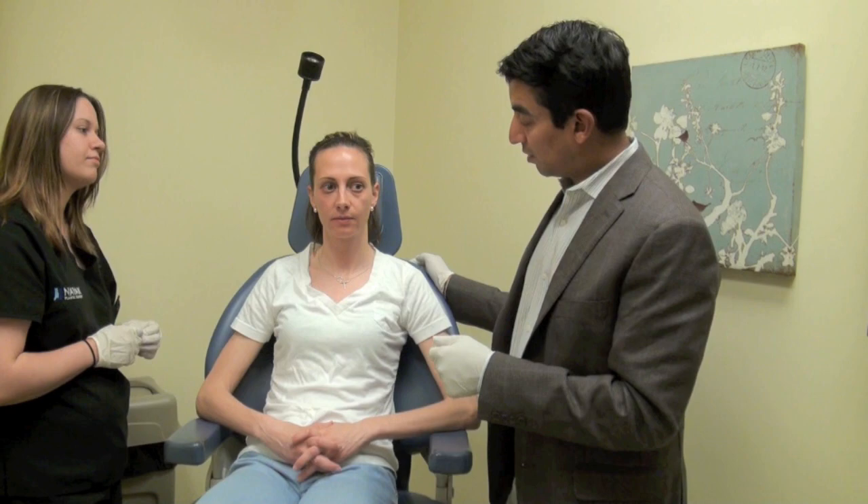So today, what we've done so far was we've actually filled her left side — we missed it on the camera reaction but we showed it to her in the mirror and she said, 'Oh, my bag is gone.' So we actually filled the left side under the eye. My strong preference for that is Restylane. And then in the cheek area, we've actually rebuilt the cheek area as well, and my strong preference for that is Juvederm Ultra Plus.